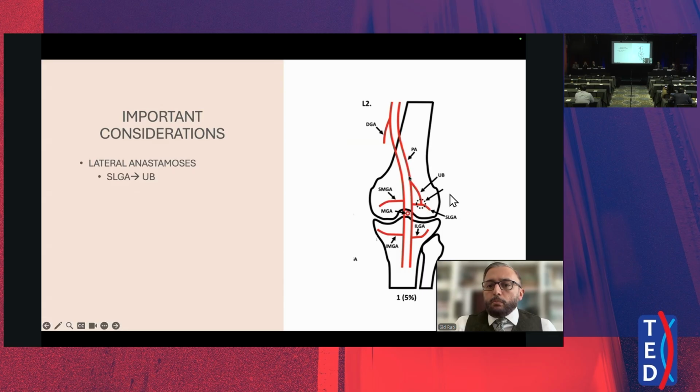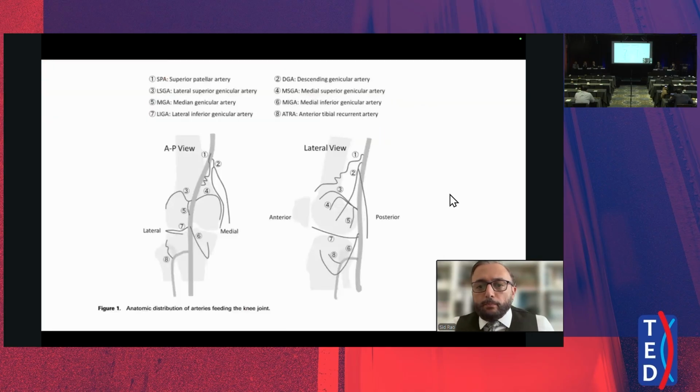And then one more is an unnamed branch in the superior lateral genicular artery. Typically, you get a lot of skin embo with the superior lateral genicular artery, but sometimes you can have this branch that goes back into the popliteal and refluxes back down into the posterior tibial and things like that. So it's very important to understand that these arteries, while on an AP view they look nice and easy, they're not. They actually are coming at you, and not in a perfect 180 degree plane.